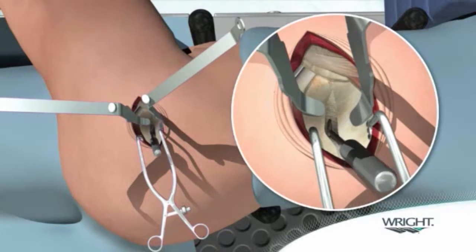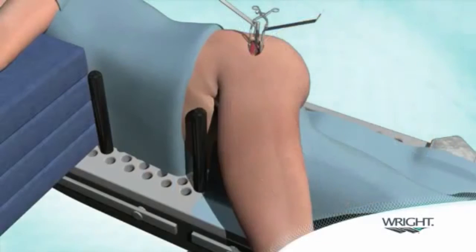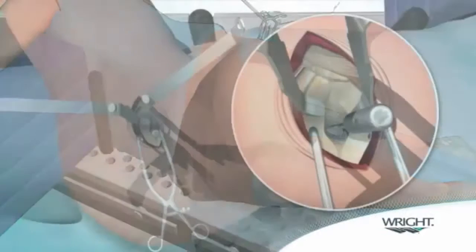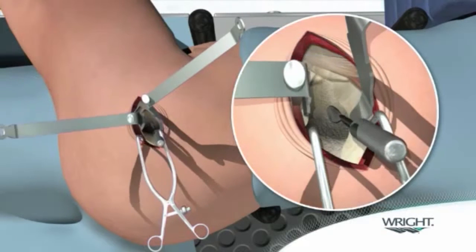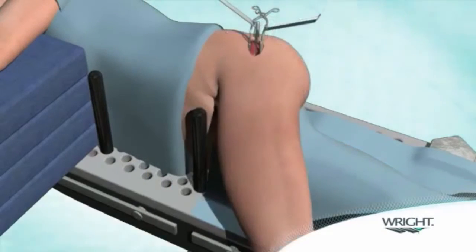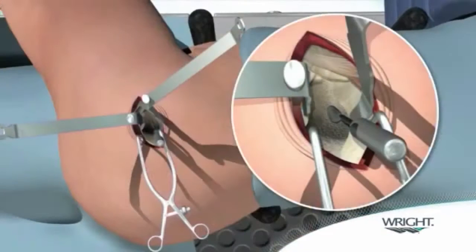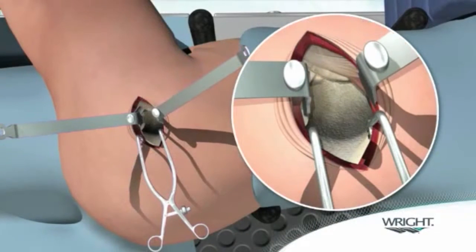The capsular attachment should be carefully peeled off the acetabular rim, extending one centimeter anteriorly and posteriorly. With the knee lifted to reduce external rotator tension, a cob elevator is placed between the posterior capsule and the posterior femoral neck. The cob elevator is then replaced with the blunt Hohmann retractor that was previously located at the posterior capsule and the knee is lowered to return the leg to the home position. The anterior blunt Hohmann is repositioned similarly and the capsule is tagged for identification during repair.